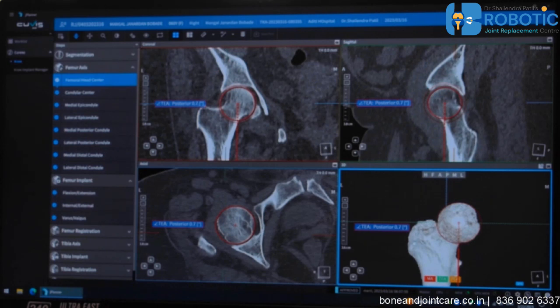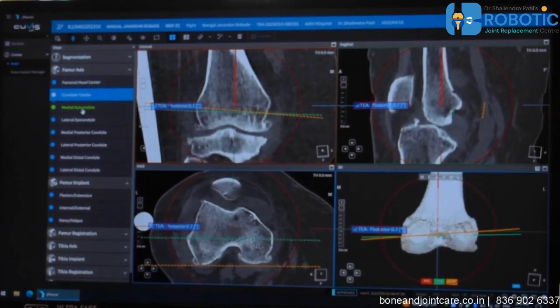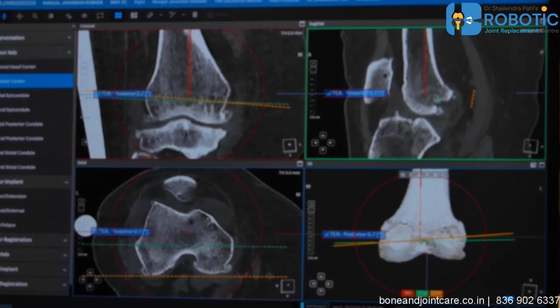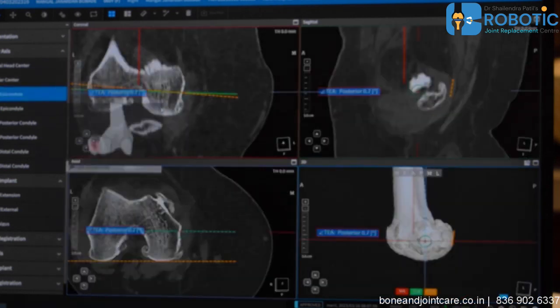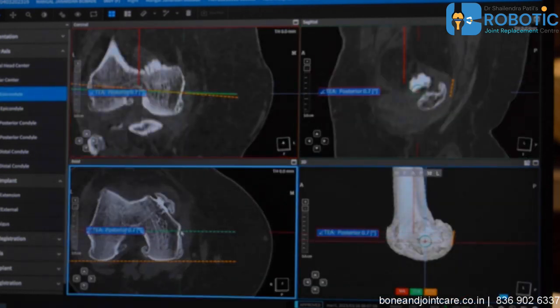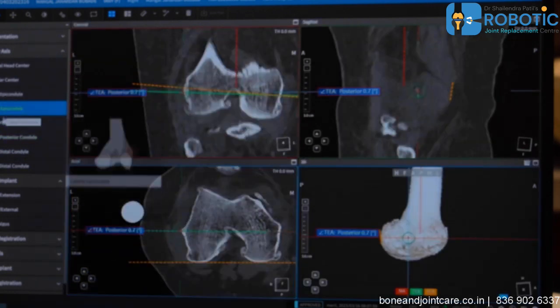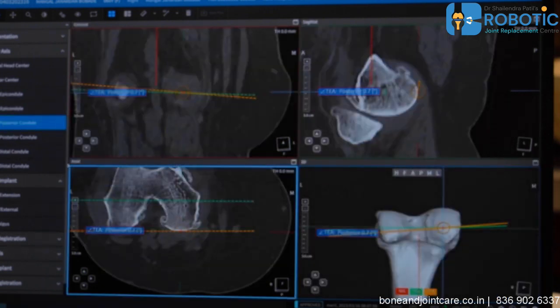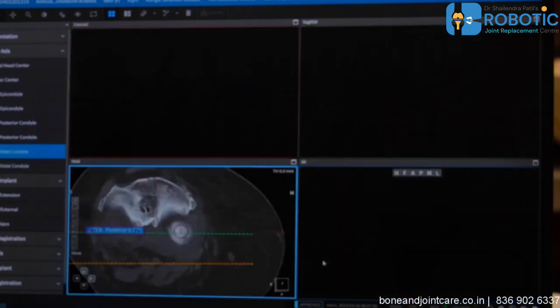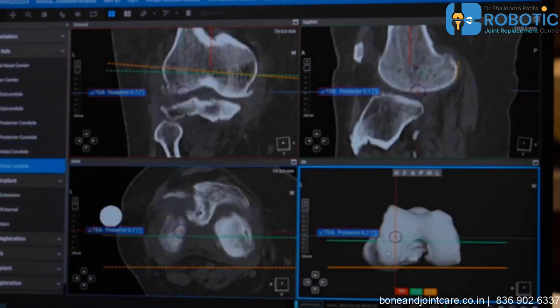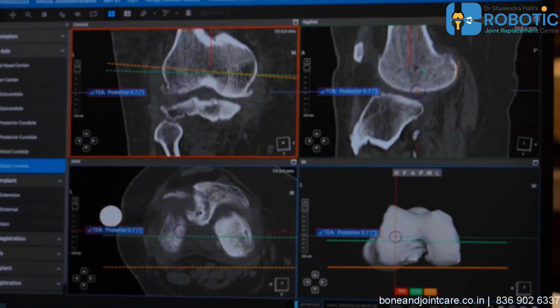In the 3D model, I can rotate and mark the condylar knee center, viewable in all planes. Other important points I register include the medial epicondyle — important for rotations — the lateral epicondyle, medial posterior condyle, lateral posterior condyle, medial distal condyle, and lateral distal condyle. In total, I register eight accurate landmark points on the software.